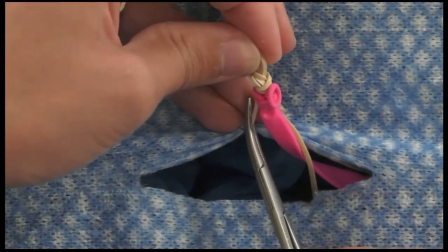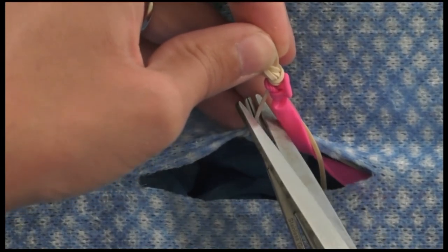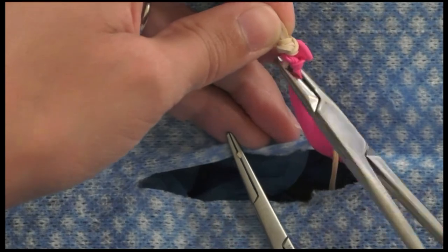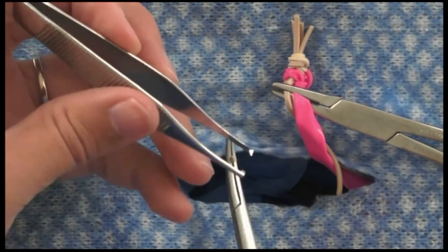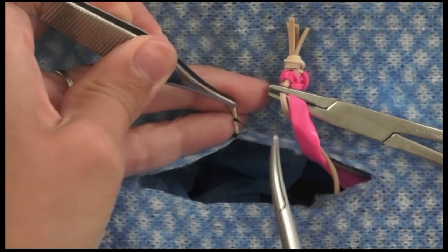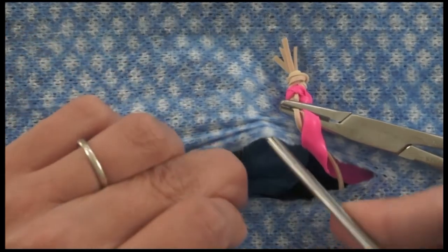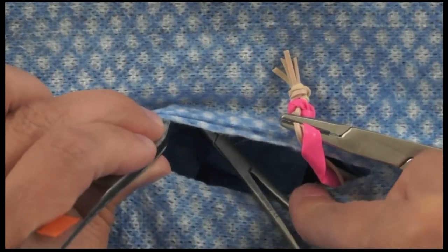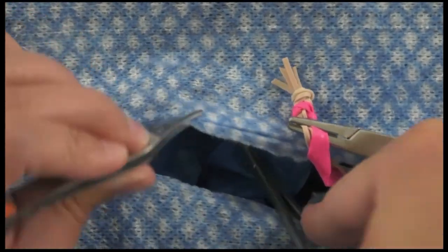Now ready to transect. You're already clamped with a hemostat so go ahead and transect. Apply hemostats to prevent back bleeding, then grasp with thumb forceps — make sure your ligatures are secure. Always grasp distal to your ligatures, never proximal. Then release. With elastic it will recoil a lot, but in real life it will recoil a little bit if there's tension on it.